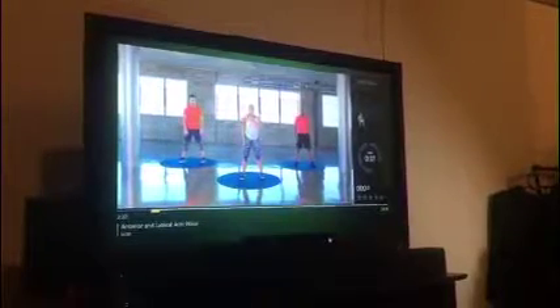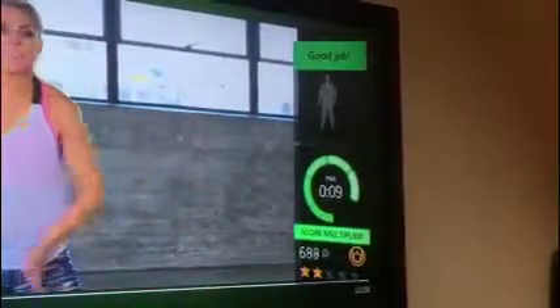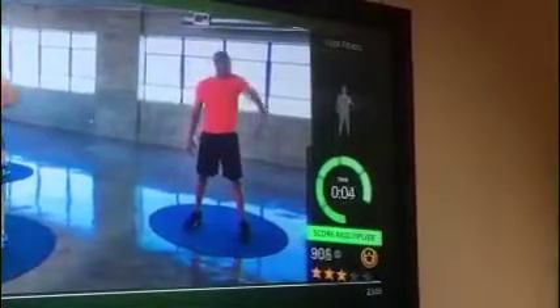Follow the motion of the instructor. You can use the box on the right side of the screen to monitor your own movements and match them to the instructor's. As you do the exercises, the Xbox will give you specific cues with colors and worded prompts if you are not performing the exercise sufficiently.